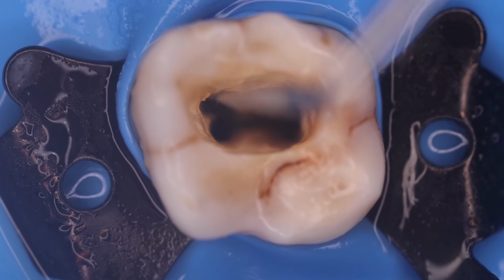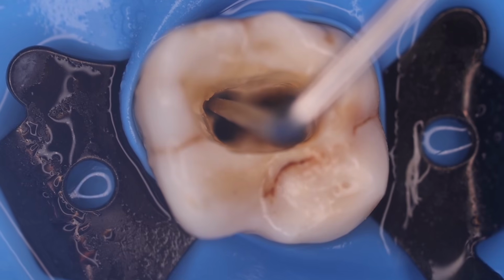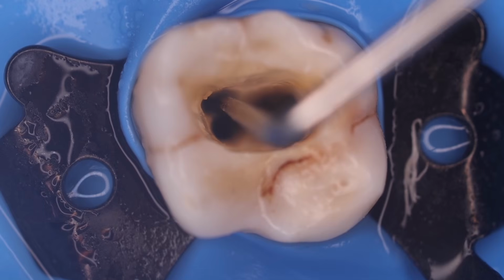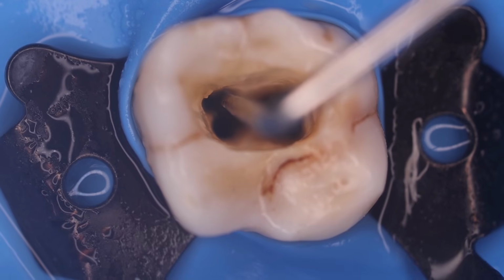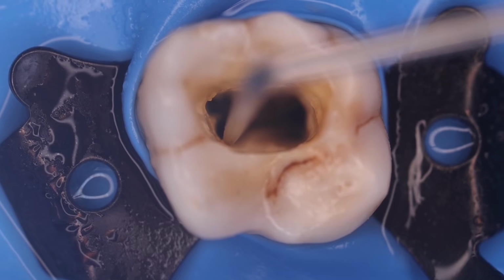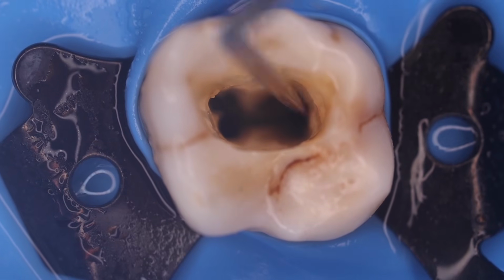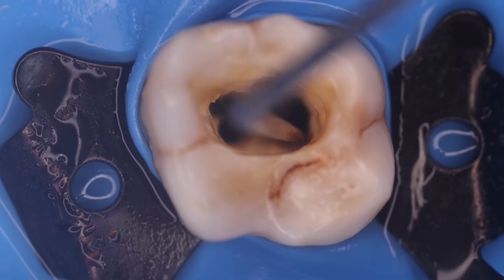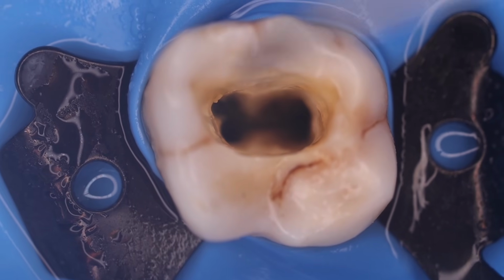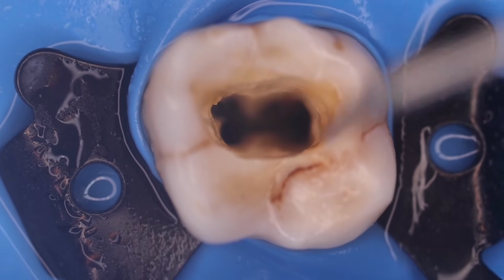So after orifice enlargement, this is the mesiobuccal canal. This is probably the mesiobuccal canal 1, MB1. Over here, this is the distobuccal canal, and over here is the palatal canal. So this is a complete straight line access where we could see all the canal orifices.